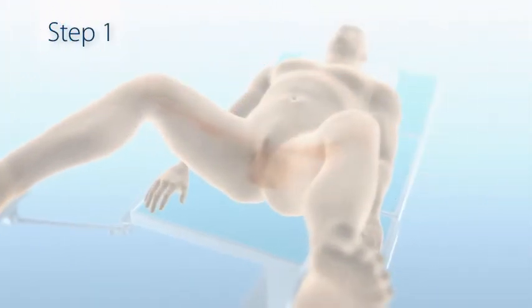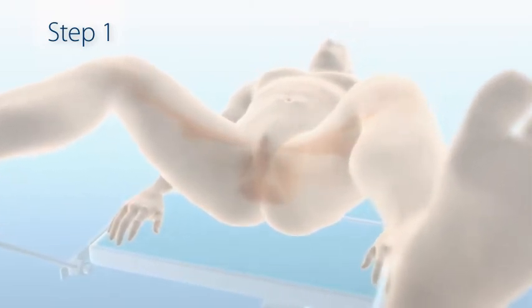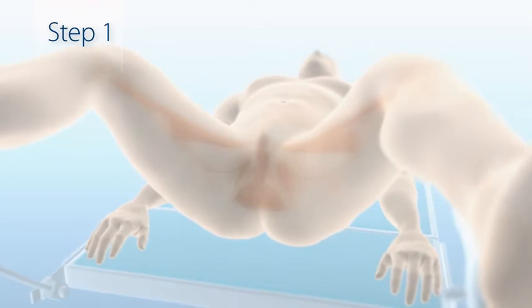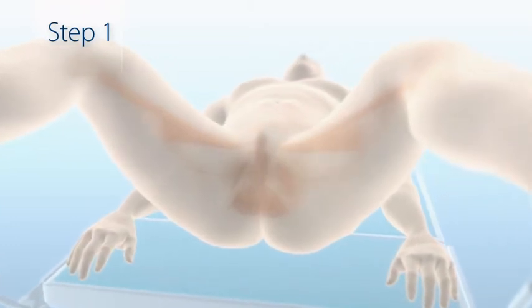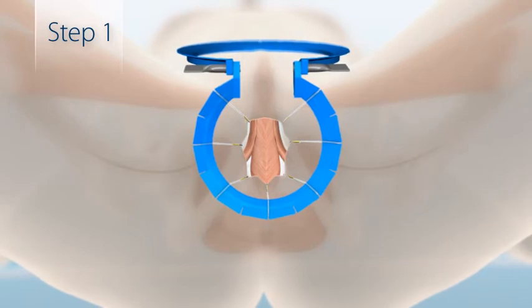To prepare for the AdVance male sling procedure, the patient is placed in dorsal lithotomy position, with legs bent at 90 degrees, and slightly spread no further than shoulder width apart. The procedure begins with a low midline perineal incision through the skin and subcutaneous tissues.